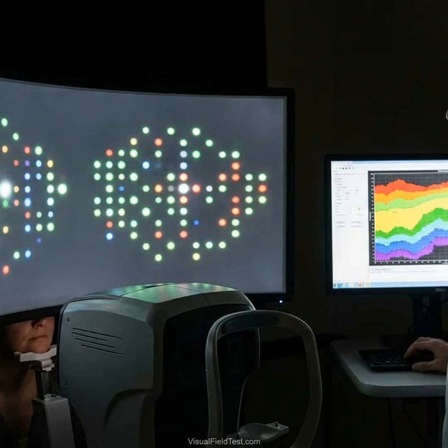While color and flicker tests may predict some impending white-on-white field loss, their performance is not perfectly consistent. Some long-term studies found SWAP rarely preceded standard field loss, whereas flicker perimetry showed a slight lead in many cases. In practice, using these tests judiciously, spacing them out, focusing on areas of concern, and confirming any deficits allows clinicians to capture early or pathway-specific damage without excessive testing burden.